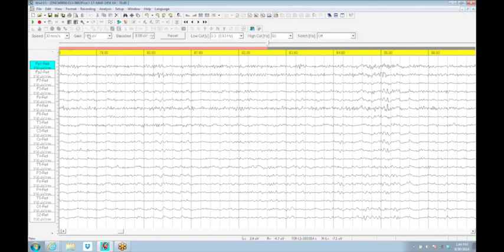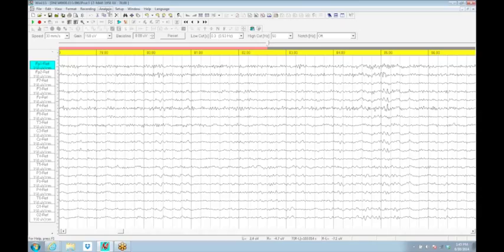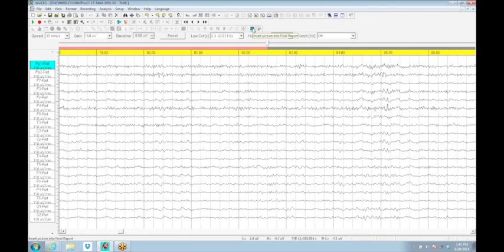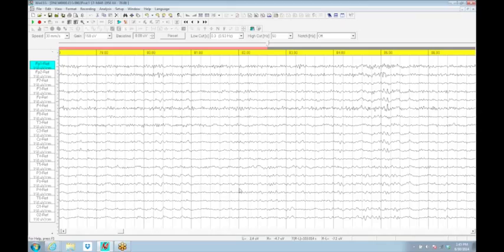This kind of software analytic is available under analysis. The EEG's got, this EEG analytics software has a lot of capability. If you open a Word document, you can take images from this, whatever's on screen, and throw them into your Word document by simply clicking on this W. You can process, find something you want in your report, click on the W and it puts in the report. You can put a series of images in.